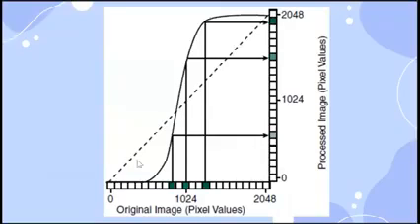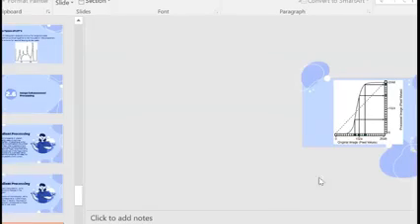So, as you can see, pag straight line portion ganiyan siya, there is no change. Okay. Pag naka-straight line lang yan siya. But if you change it from this area here, from the straight line into this graph, itong curve na ito, that means that you have changed both the brightness and the contrast of the image. Okay? So for example, ganito yan siya.